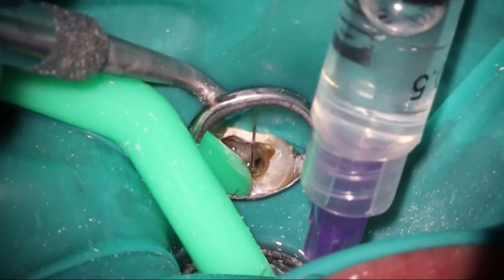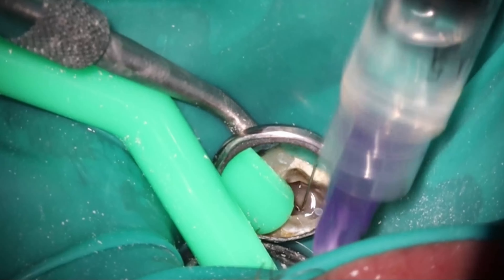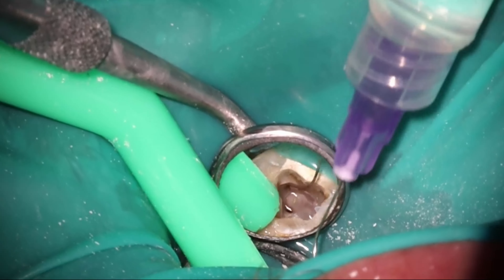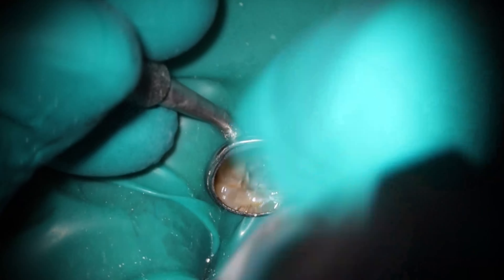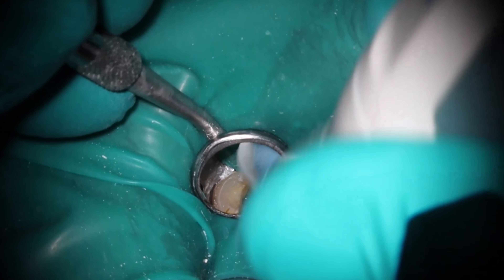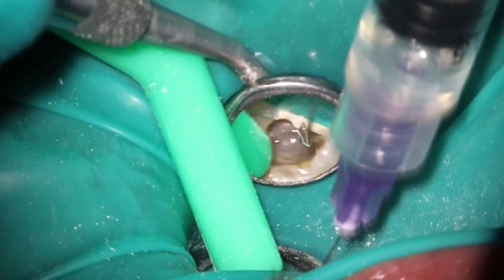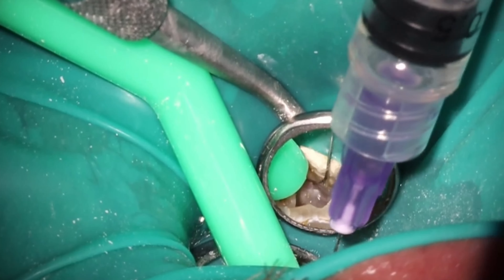The rest of the case is pretty straightforward. That is one thing I will say — I think it's probably an over-reliance on hand files. I very regularly see ledges, short-cleaning, and other issues. If you are going to be doing a pulpotomy, I would recommend taking an eight or a ten down about halfway, then taking a flaring file like the 2006 that I use, and just removing that first coronal third of pulp tissue. That's enough to get space for the calcium hydroxide to get inside, so you don't have to worry about the patient being in pain. And that way you're not going to ledge or cause other issues. I can handle it — I get past ledges and blockages all the time; that's part of what I do as a specialist. But if you're a general dentist watching, that would be how I perform the pulpotomy, or pulpectomy at that point.